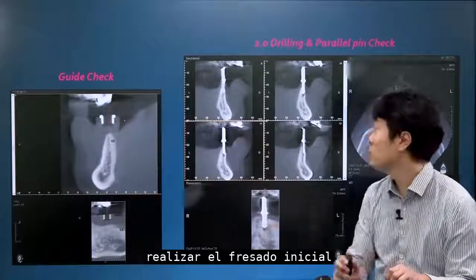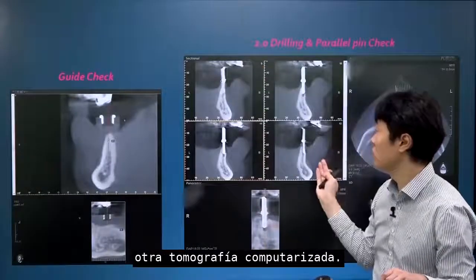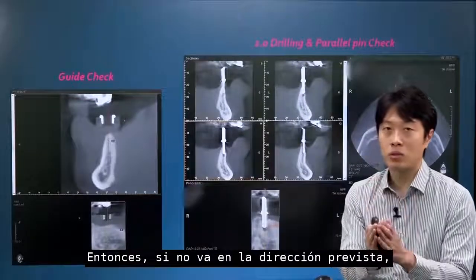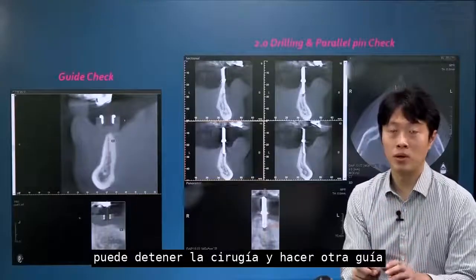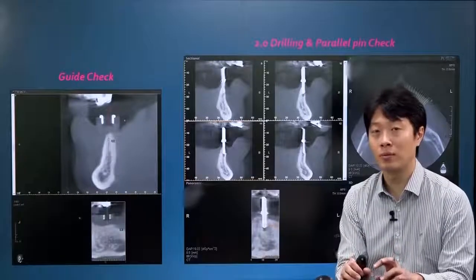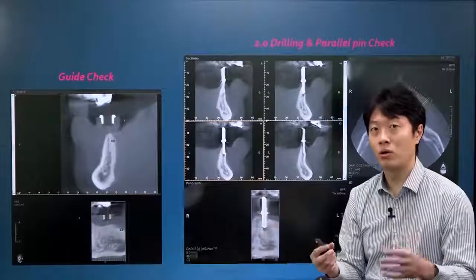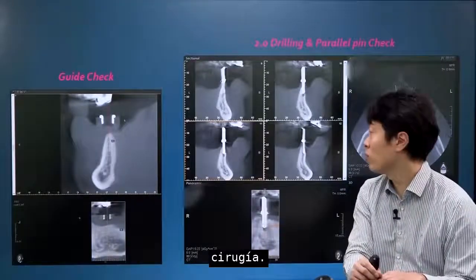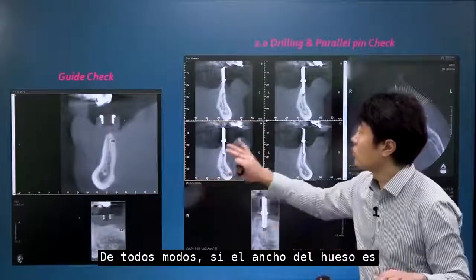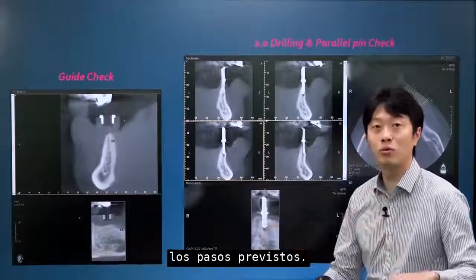If it's consistent, you can proceed with the surgery, but I recommend checking once more while performing the surgery. Perform initial drilling. Then attach the parallel pin here and take another CT scan. If it's not going in the intended direction, you can stop the surgery, make another guide afterward and perform the surgery. Or, in my case, I open the flap to proceed with the surgery. Anyway, if the bone width is narrow, it helps to check from time to time whether the surgery is being performed in steps as planned.